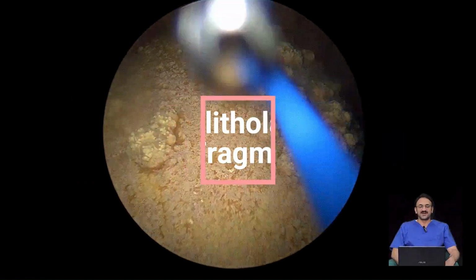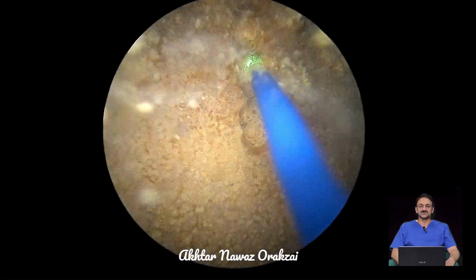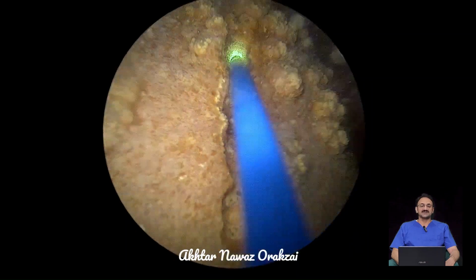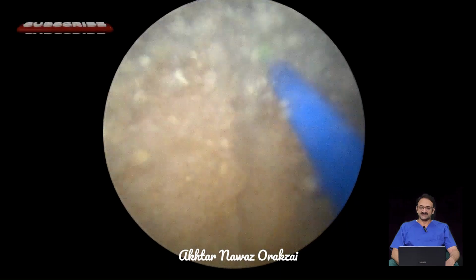Assalamu alaikum. Today we are discussing dealing with a large stone of the urinary bladder. It was a young patient who is diabetic and hypertensive.